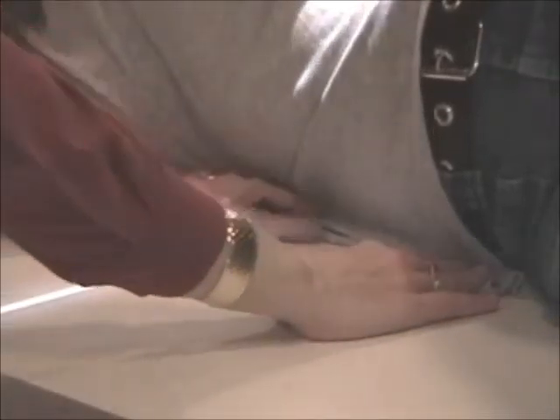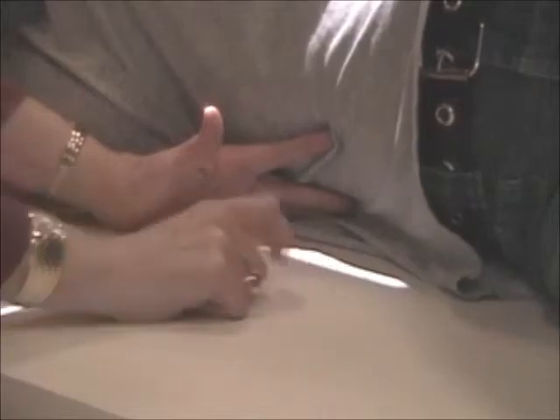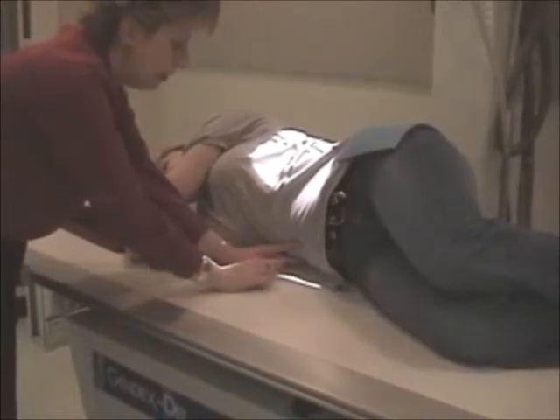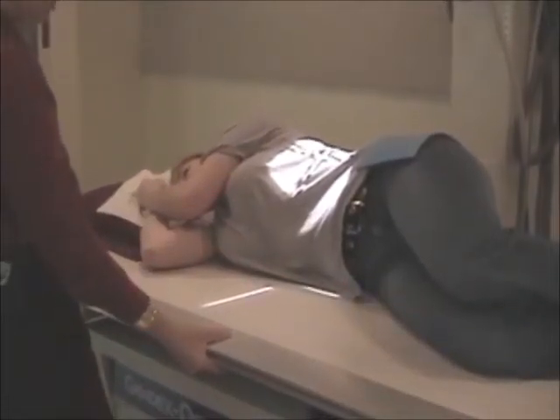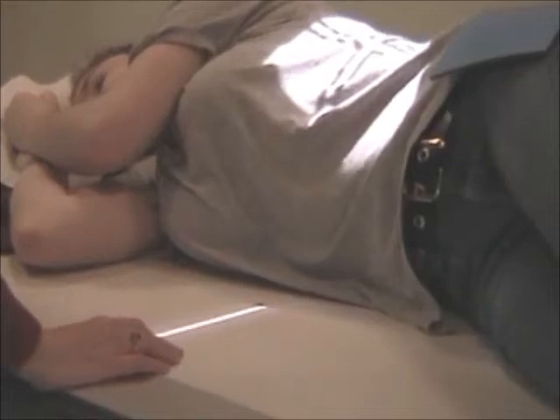Now I'm going to have you focus on the tabletop here. When I did that, look what happened. I'm actually X-raying tabletop. I have my 10 by 12 collimated field set with the gauge, and if I'm showing tabletop, I'm giving the doctor no valuable information there. So I'm going to adjust that centering a little bit to give him more of the body, give her more of the body, to see perhaps more of the stomach or small intestines.